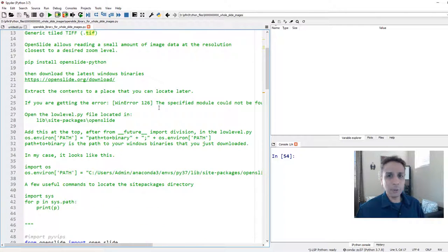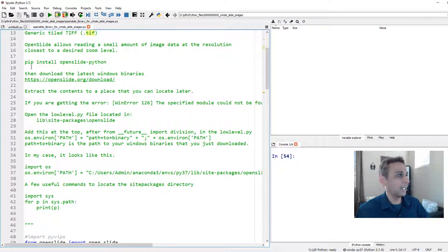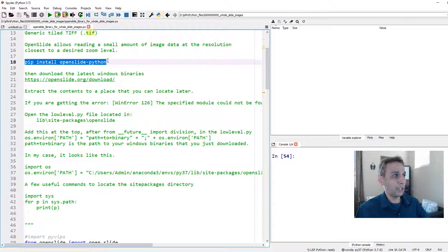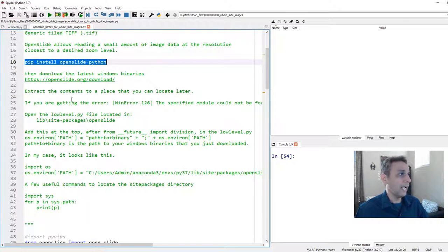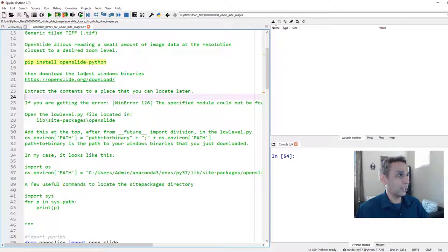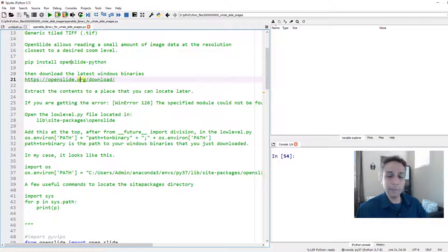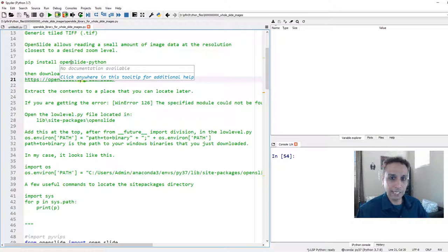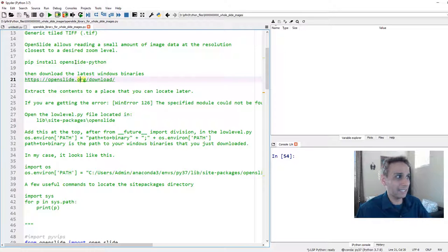To download OpenSlide, go to openslide.org/download. It's a two-step process. First, go ahead and pip install openslide-python as you normally would. But once you do that pip install, you're not done — that's just step one.